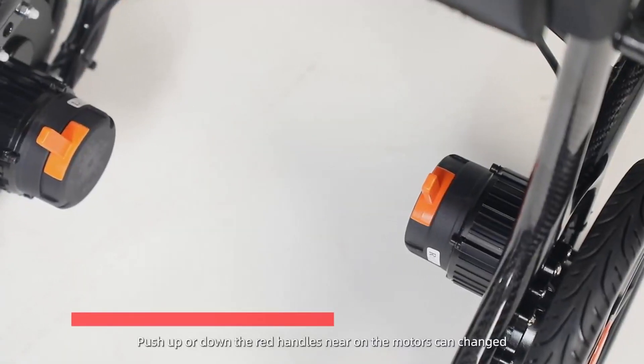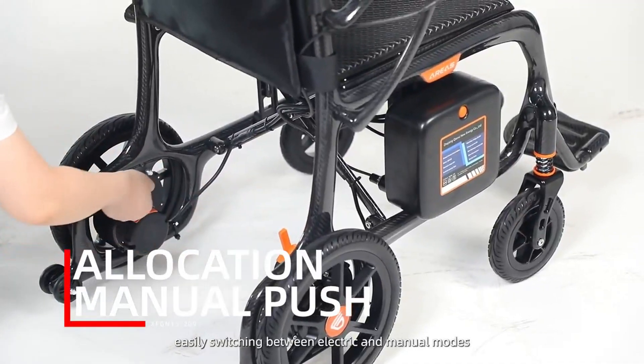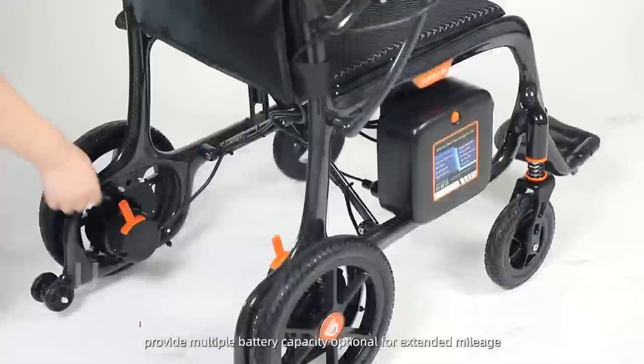Push up or down the red handles near the motors to switch easily between electric and manual modes. Can install one or two lithium batteries according to your requirements, with multiple battery capacity options for extended mileage.